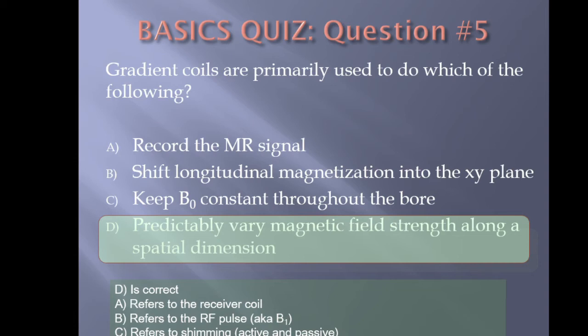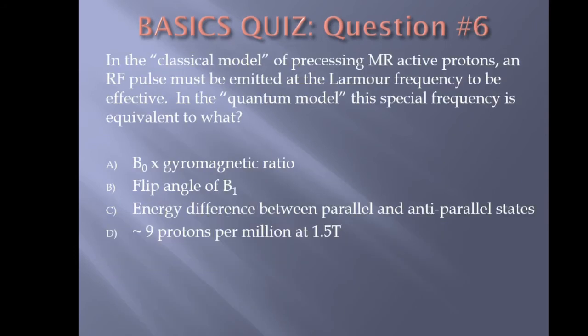And then, when you're actually scanning, you've seen people shim before. What they're doing is they're just adjusting the frequency at which they're sending out RF pulses and listening. And in some cases, when you're using a shim volume, they're actually altering the magnetic field using gradients supplementally. So kind of neat, but it has real life purpose.